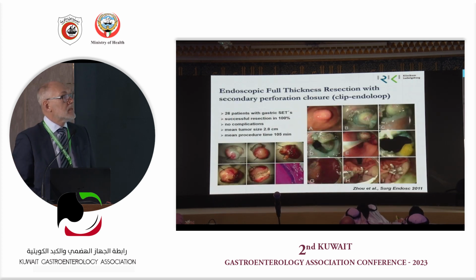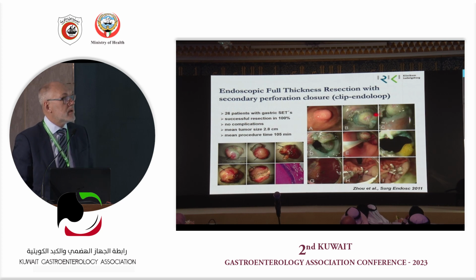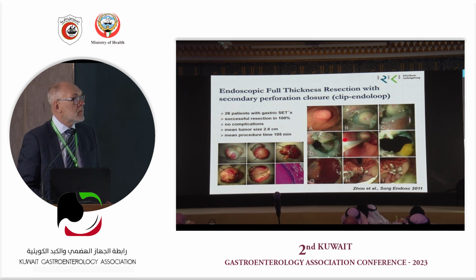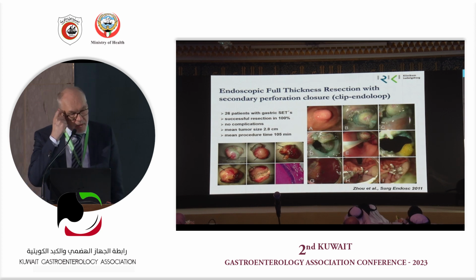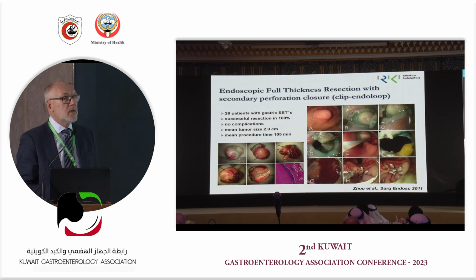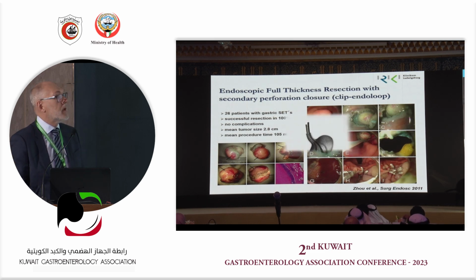In Southeast Asia, they're doing a lot of this open EFTR. So they make a perforation. Professor Zhu from Shanghai is an expert in it. I'm always a little bit afraid when I look at his interventions. Making a hole, taking it out and then somehow stitching it up. It works most of the time, but actually currently I think we do not have absolute control over closing and complication treatment like the surgeons have.